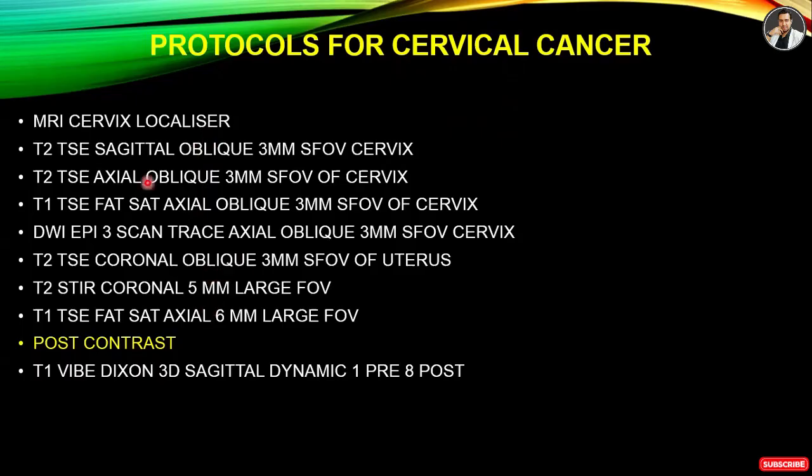The thickness of the protocol is 3 mm. Not more than 3 mm. One has 5 mm. After the contrast, dynamic contrast. I got this dynamic contrast from MRImaster.com.